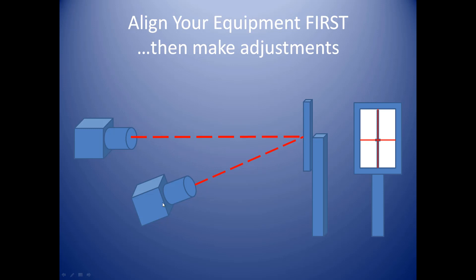You're also at 40 inches. It's very easy to achieve this distance — if you pull your camera back in your room you'll feel a click, which is a camera lock telling you when you're at 40 inches. It does the same at 72 inches. If your tube is affixed and doesn't move, these distances don't necessarily apply, but in most cases you have flexibility to angle and acquire these distances. If you are angling the camera, always re-correct and center your crosshairs back to the center of the bucky, otherwise you'll throw your shadow completely off the film.